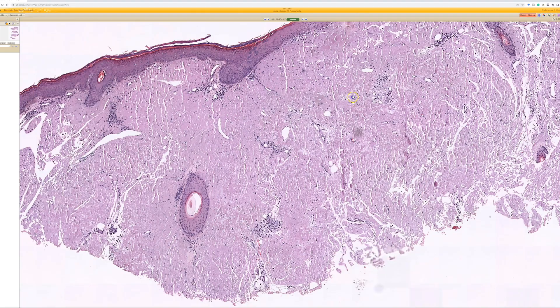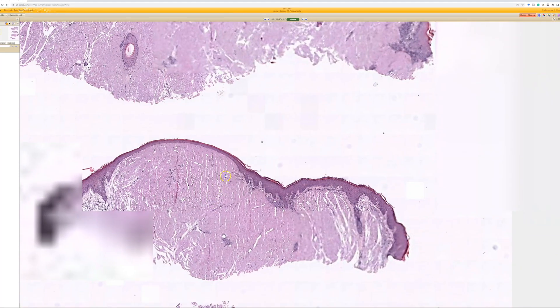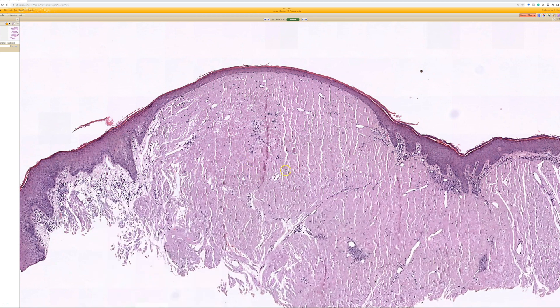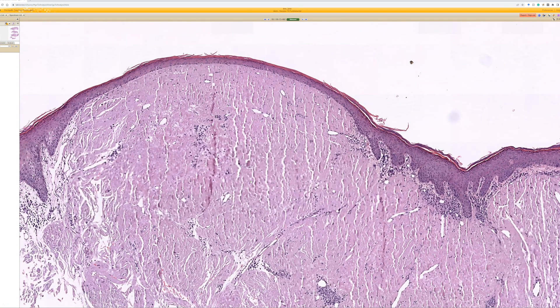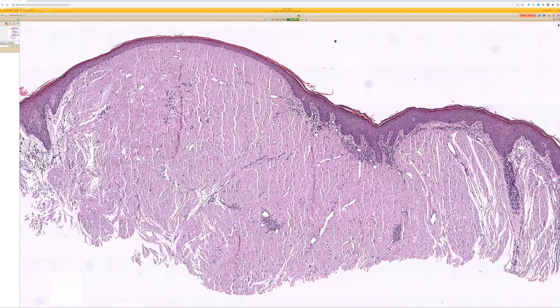I find this really hard — it took me well into practice to wrap my head around it. This is a good example with a nice cracking artifact. There is one other thing that looks a little like this: colloid milium, which is kind of like degenerated nodules of protein and solar elastosis mixed together. I've actually seen a case that ended up being systemic amyloid deposited in older, sun-damaged skin that looked like colloid milium — but mass spec confirmed it was amyloid. So if you're thinking colloid milium, always keep amyloid in mind and if there's any doubt, send it out for mass spec.